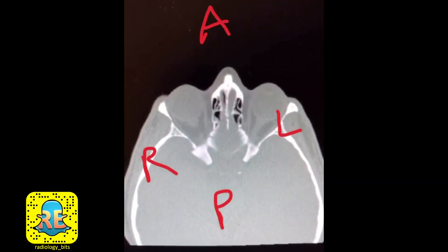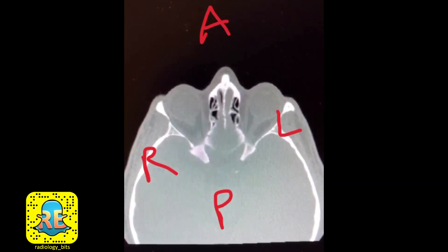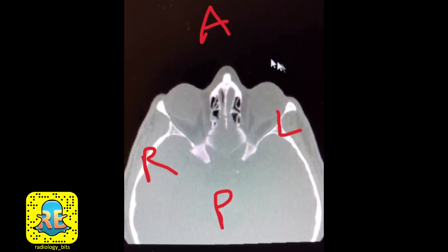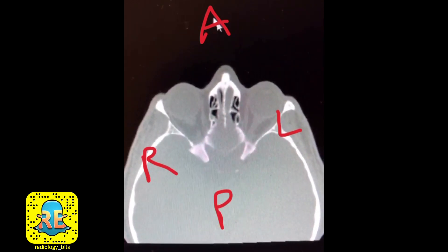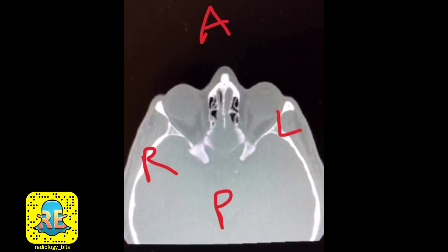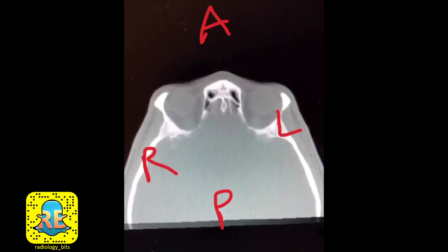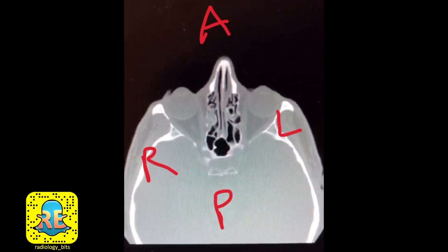We're looking at an axial image of the paranasal sinuses. You have anterior here, posterior here, right on this side and left on this side. For students, you're looking at the patient from the feet, and we're going to scroll from above downward.